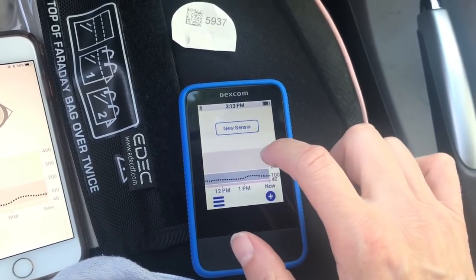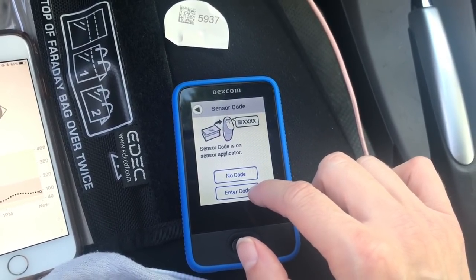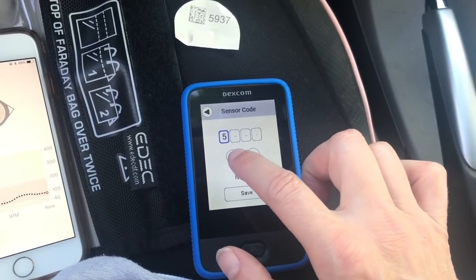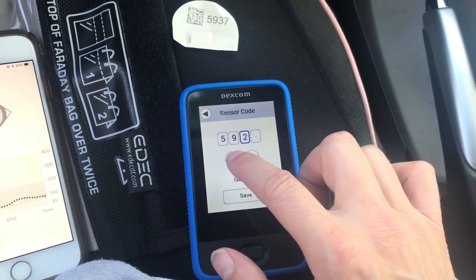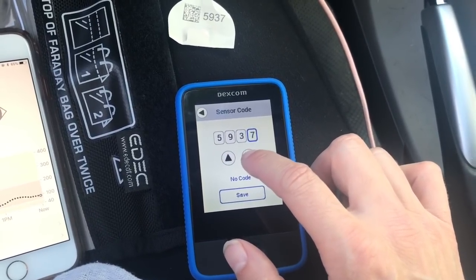We're going to do new sensor, and we're going to say enter code. I'm going to enter five — this was the one we had before — nine. Or the one that is actually in her arm right now, I should say. It's the code we used to start this originally.